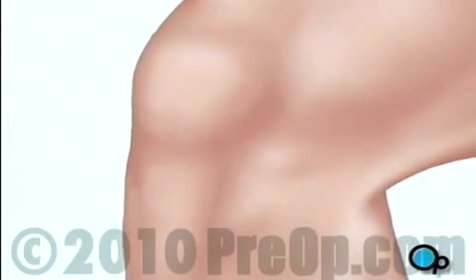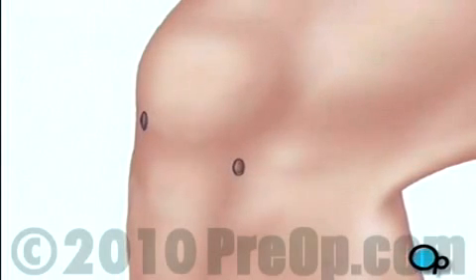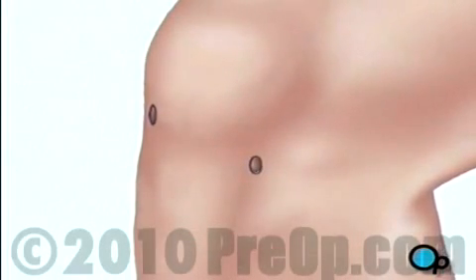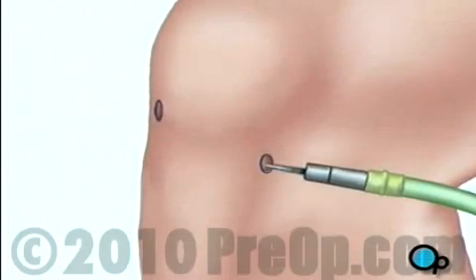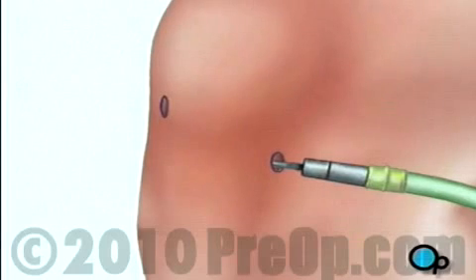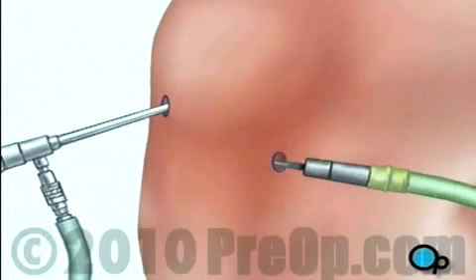To perform arthroscopic surgery, your doctor will make a few small buttonhole-sized incisions in the area around the knee. An arthroscope is a very small video camera that your doctor uses to see the inside of your knee and to guide the surgery. Before your doctor can insert the arthroscope, the surgical team must inject a clear fluid into the joint. This fluid will inflate the interior space and will help your doctor by providing an unobstructed view and enough room in which to work. The actual surgical instruments will be inserted through one or more other small openings.